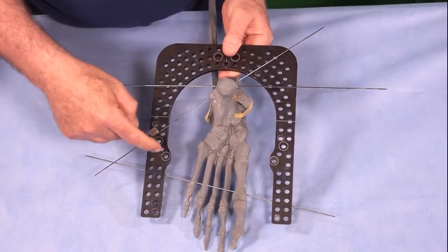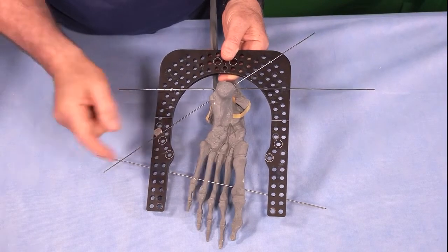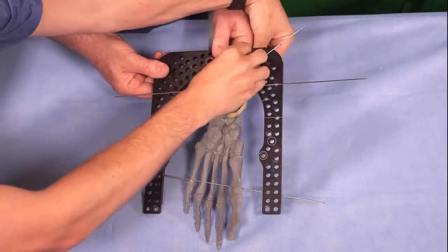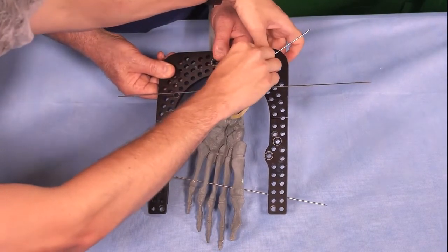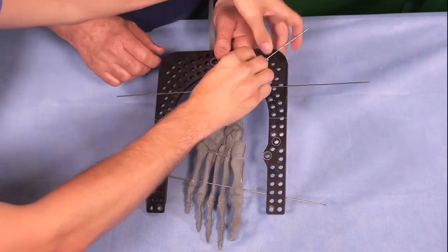I'm also paying attention to the holes that have the circles, because that's where my struts are going to go. And I don't want to put a wire crossing a hole where I might need it for a strut. Now once I fix a wire here, I can no longer move it side to side. So I have to make sure I have it in the right position before I lock things down.